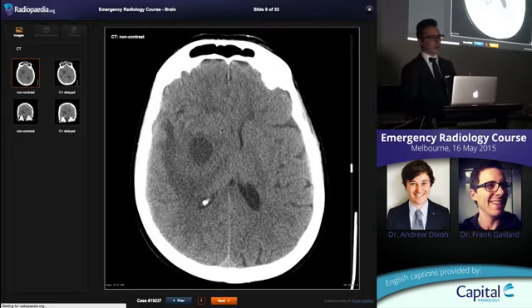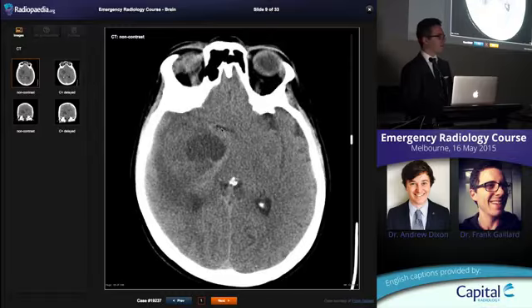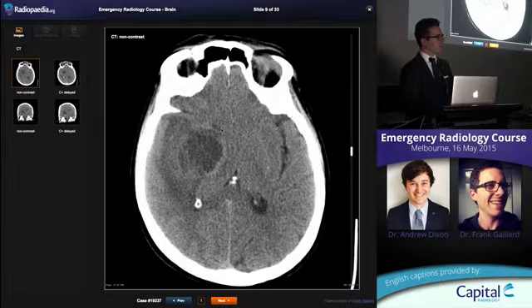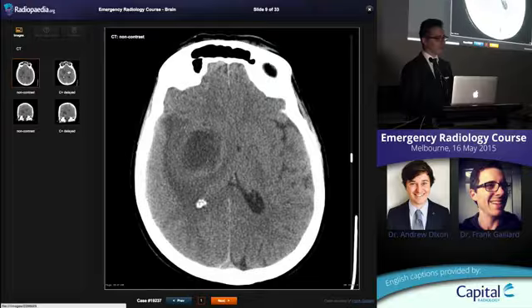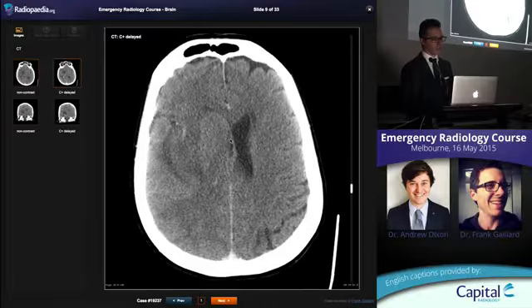The other common scenario that you'll encounter is a patient that comes in with headache, typically in the morning, worse on straining, your typical raised intracranial pressure headache, or a seizure, and you do a non-contrast study and you see a lump. There's no history of cancer. You give contrast, because contrast is a good thing to give, and you see a lump. You still just see one.